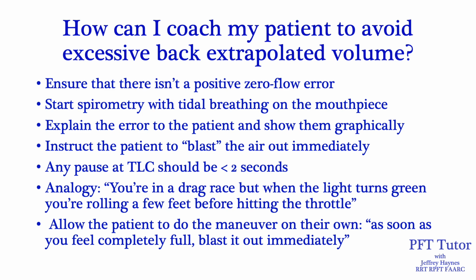Another strategy that's pretty effective when you're having this problem is to allow the patient to do the spirometry maneuver on their own. Sometimes we don't make great dance partners, so I'll tell the patient, okay, just do it on your own. You start off breathing normally. As soon as you're ready, take a full breath in. As soon as you feel completely full, blast out the air immediately.